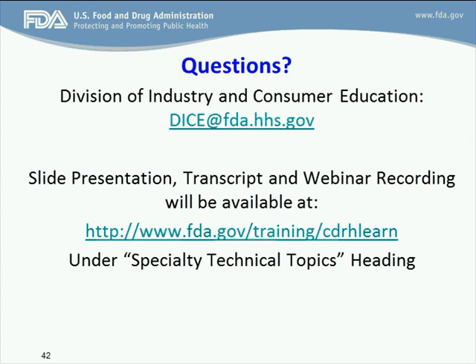Now, from what I understand, that is a change in course from what is typically being employed at the present time. I know that historically, at least for determinations that we have conducted on cleaning, we've been following 3 markers, namely protein, carbohydrate, and hemoglobin. Is the agency saying now that 2 markers are sufficient? And if so, which is what I derived from the answer that you just provided, and if only 2 markers are required where we were normally providing 3, which of the 3 markers should we be providing, and on what basis?